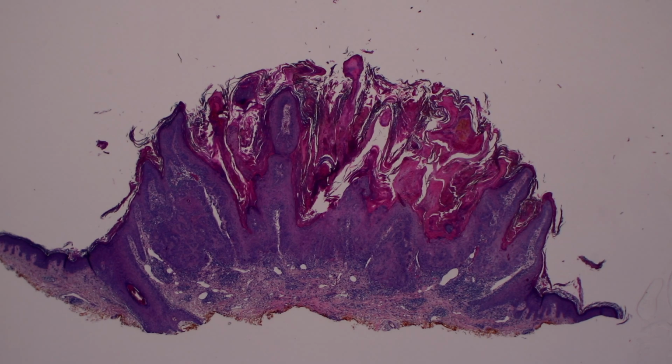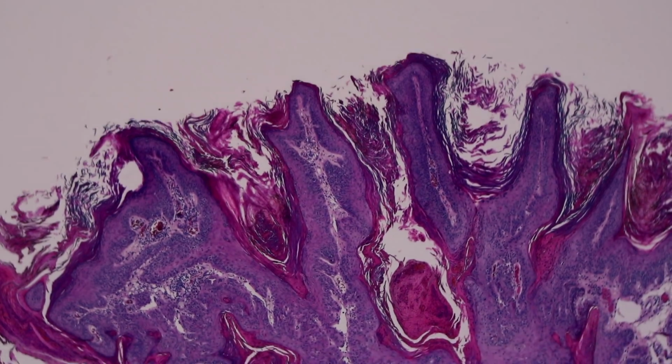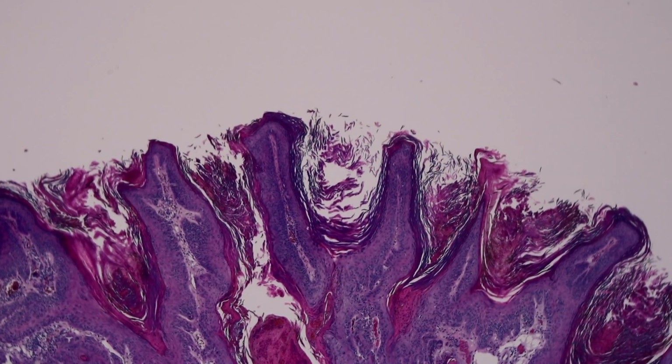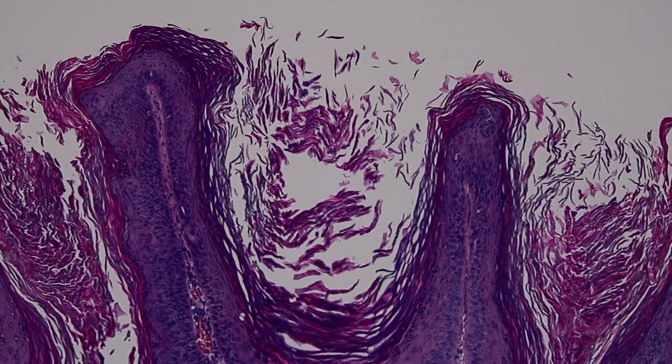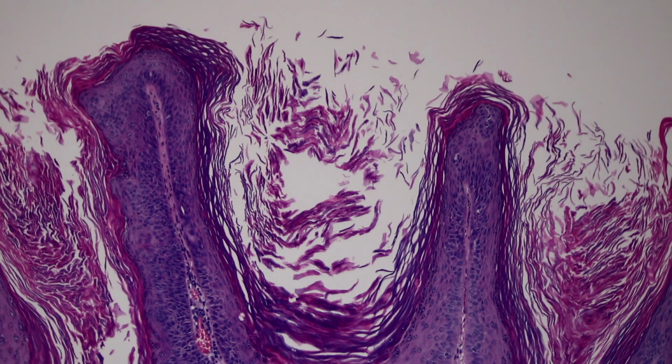So just be careful of that, and let me show you one more example that I think really demonstrates it very nicely. This one, really just on the top, looks perfect for a wart. It's kind of a dark stain on this one, but it really does look very verrucous. These tips don't have much atypia at all. They really look just fine for verruca vulgaris. I mean, that'd be perfect.